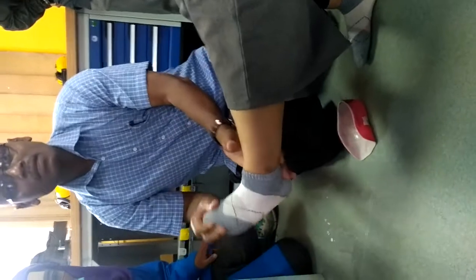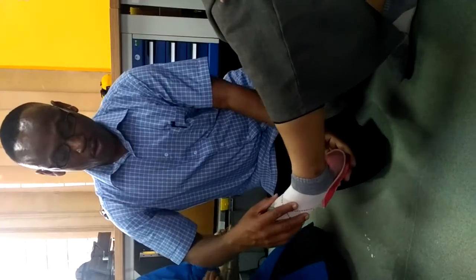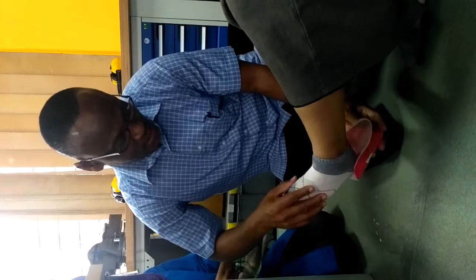Before that, the first step: we have to check the skin. And then I am going to do donning. We call the process donning. Donning is put on; doffing is take out. I am going to don my orthosis — not from the top like that. Slide in.